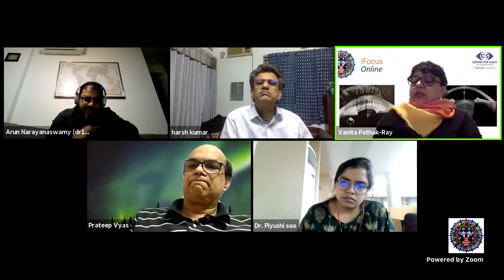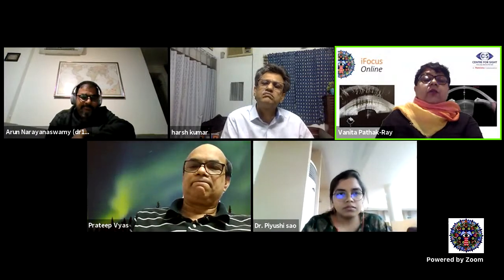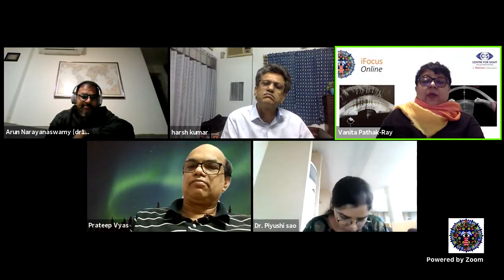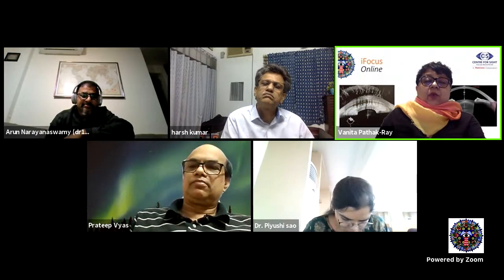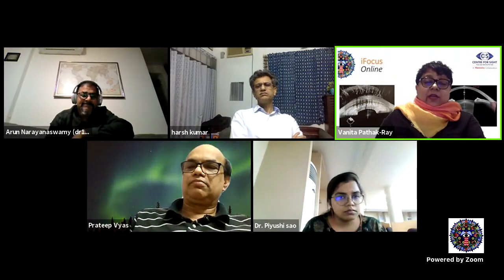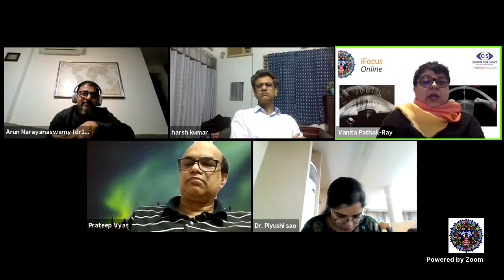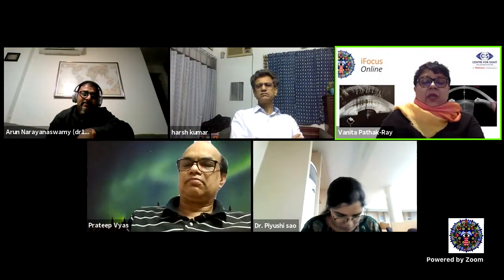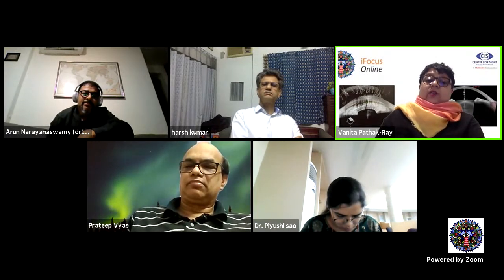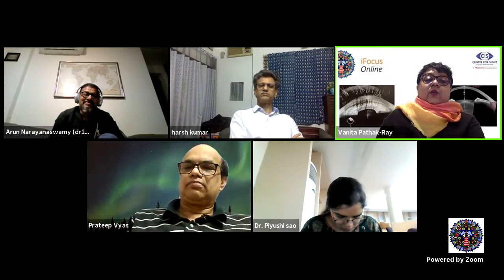Right. Just getting back to the indications, you did make a point about documentation for medico-legal purposes. A case comes to mind where a patient had visited 4 different ophthalmologists in the last 2-3 months and was not able to get his problem sorted, which was a very vague brow ache. He too was a high myope, -6 something in both eyes. And lo and behold, he actually had primary angle closure. To document that, I had to do a UBM to show it to him.